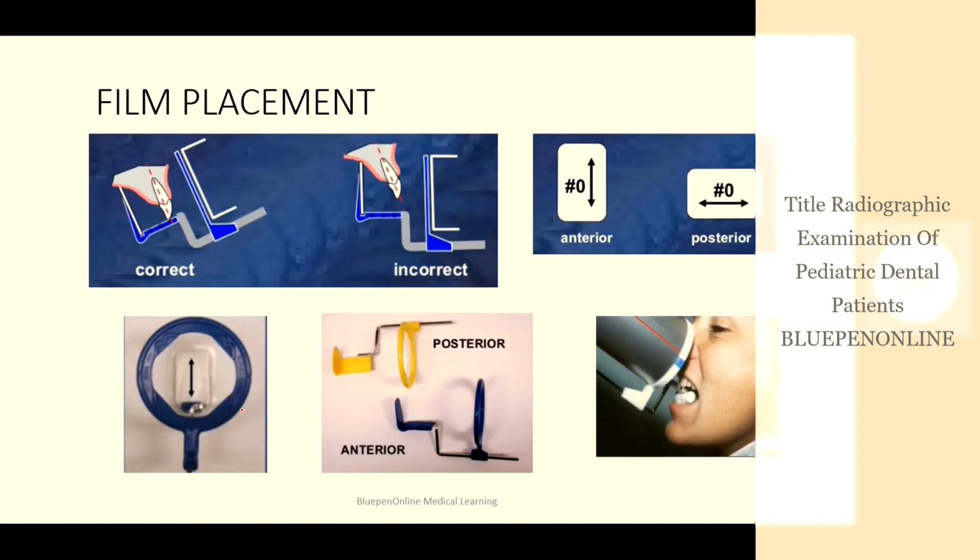Now, how do we place a film in case of the paralleling technique? As I said, the film must be placed based on the long axis of the tooth. How the tooth is angulated, based on that, the film will be placed. This shows the incorrect method where the film is not parallel to the long axis of the tooth. In case of an anterior tooth, the film must be placed vertically, whereas in case of a posterior tooth, it must be placed horizontally. Within the instrument or the extension cone or positioning device, it must be placed like this. In case of posterior, the yellow colored one is used, whereas in case of anterior, the blue colored one is available.